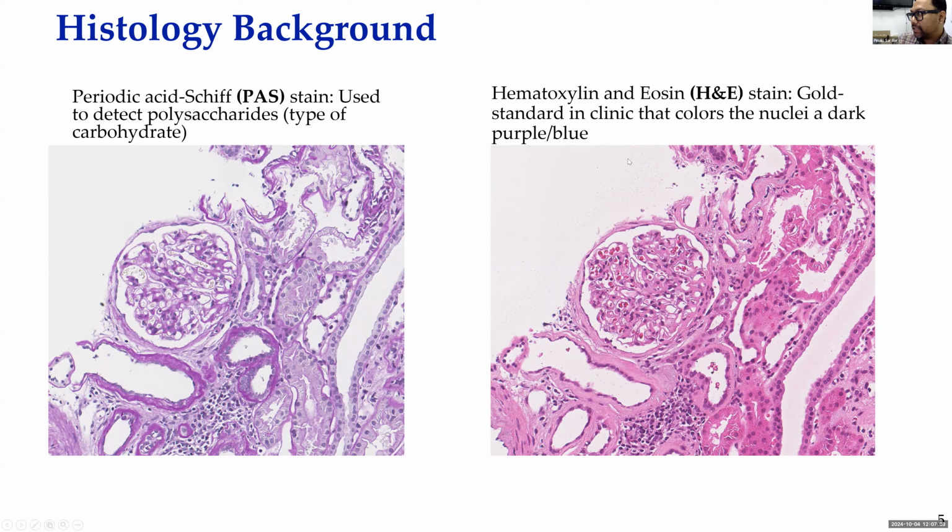For example, in this case, this tissue is stained by something called hematoxylin and eosin. This tissue is stained by something called periodic acid-Schiff, right? And it basically gives us some sort of contrast in the data or in the image, or maybe under the microscope, to have a better understanding of what is going on in the underlying disease, in the underlying tissue, to diagnose disease, right?